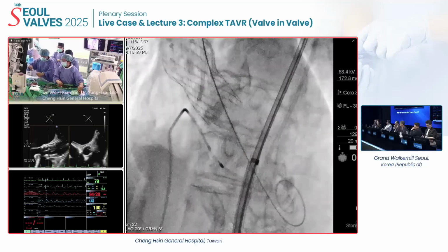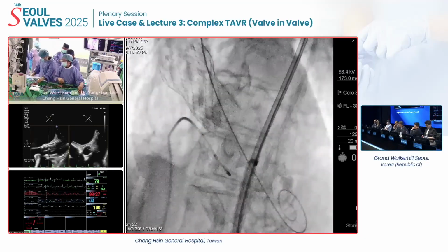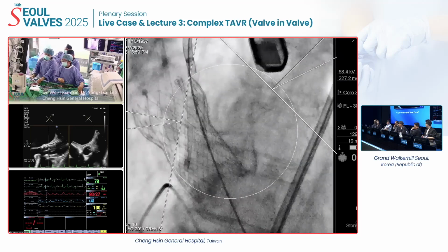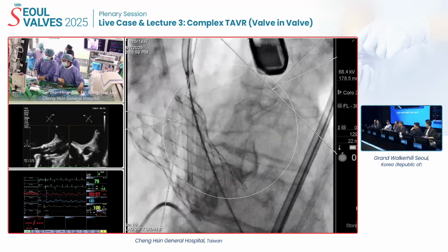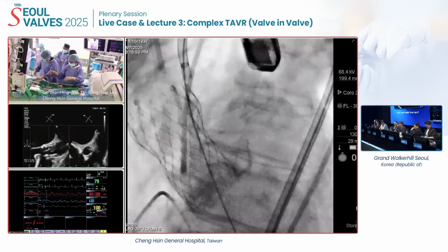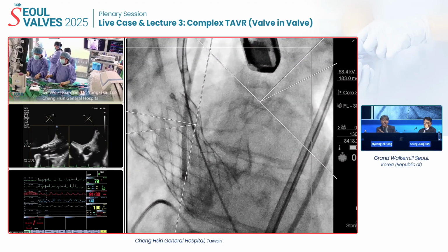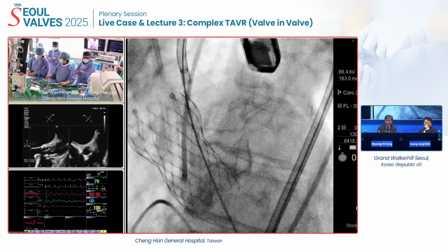This session will be closed at 4:30, but this is the last session, with the live demonstration and the TW's lecture. We use the fishing technique demonstration. We have time, so we observe what's going on continuously. I'd like to learn something new.